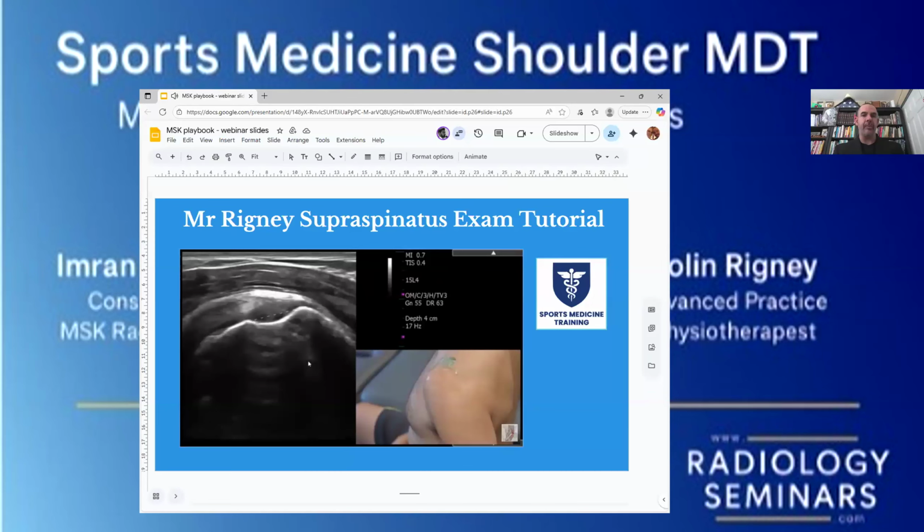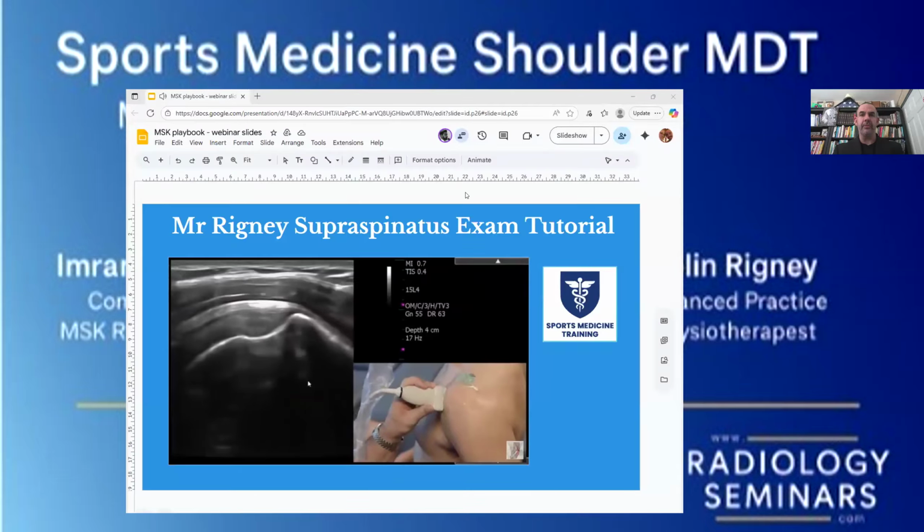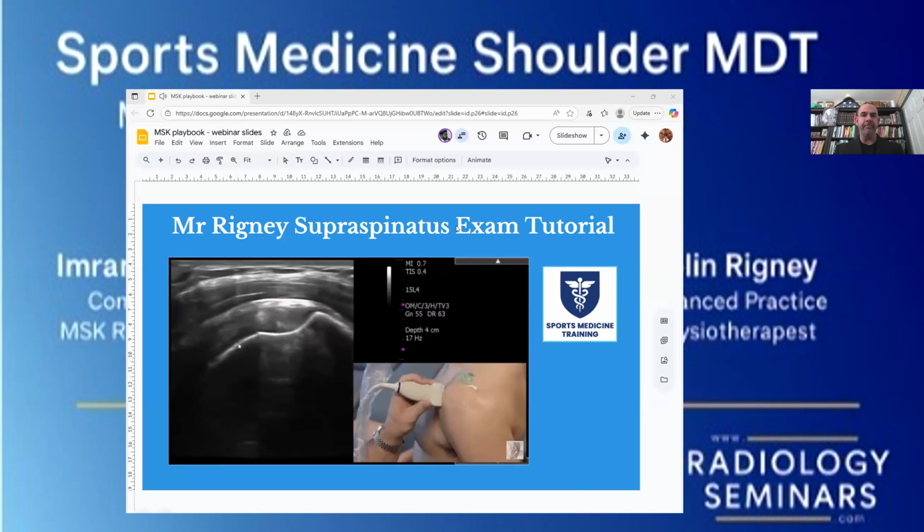So just so you understand bony landmarks, you understand the anatomy. We're not just anatomy generalists. You have to be able to master these positions. Keeping our patient in this position, again, let's find that view. See how this hooks in? This is this hump right here. This helps us separate the footprint of the insertion versus the articular margin of the humerus. And our tendon is basically from here to here.